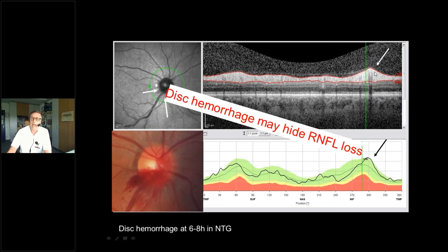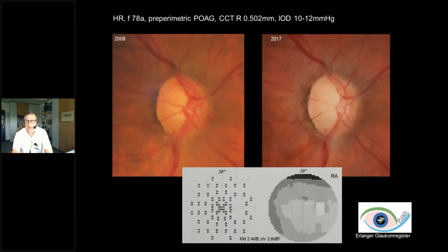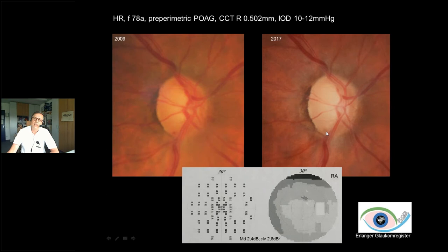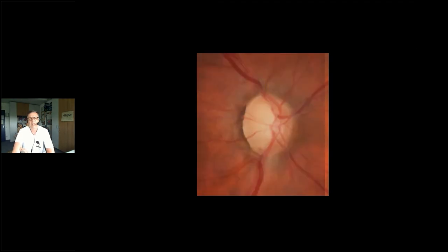First there is a hidden loss of nerve fiber layer, then a rapid loss after the disc hemorrhage diminishes, and over years RNFL thickness loss continues. In a pre-perimetric open angle glaucoma patient from 2009 to 2017, we see disc hemorrhages, pronounced RNFL loss in the dark area, and the visual field is still not too bad. Flickering the disc confirms the patient is worsening in the temporal inferior sector and slightly in temporal superior.